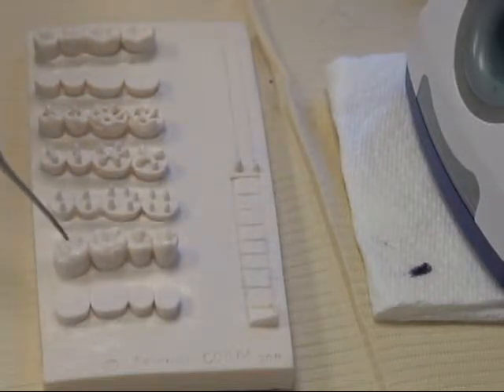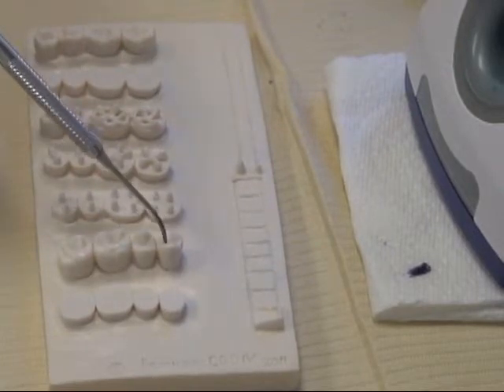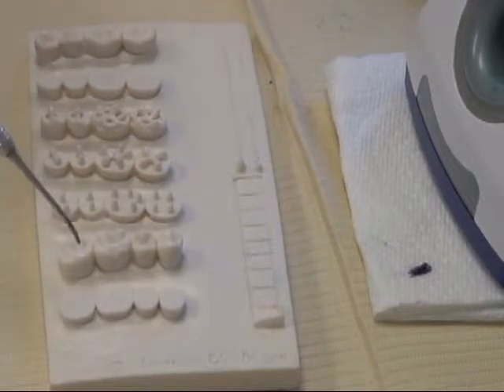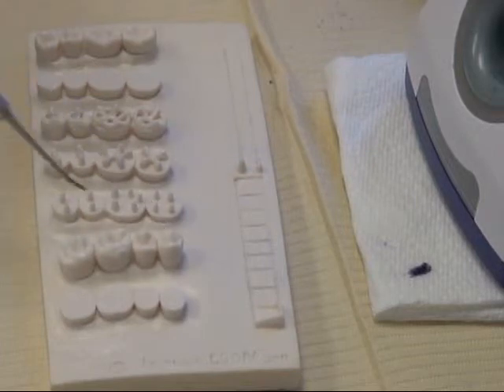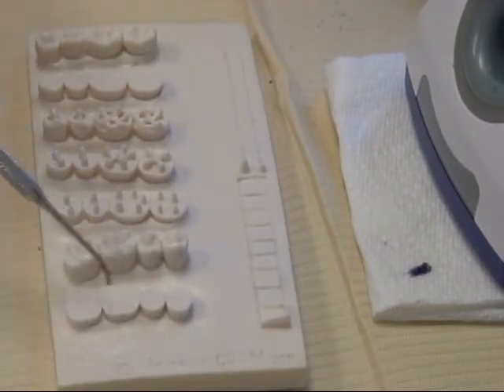In this section here, this happens to be upper right molar, tooth number 2, 3, 4, and 5. What we want you to do is then create, like you've done this tooth, only it's a little bit different anatomy. You'll notice some different anatomy on these teeth. So we want you to create that by letting these be your models and then create the wax up on these.